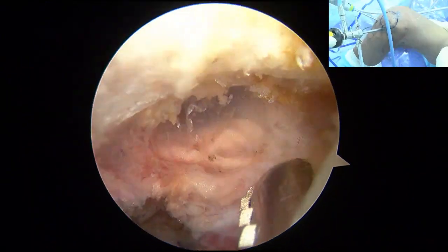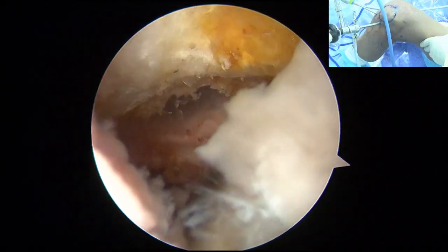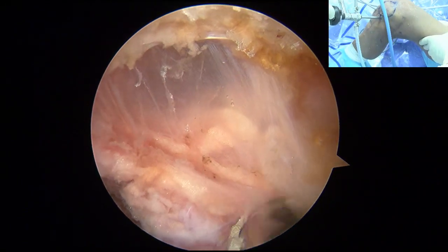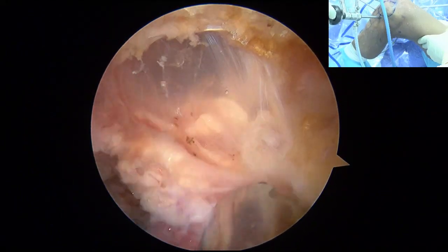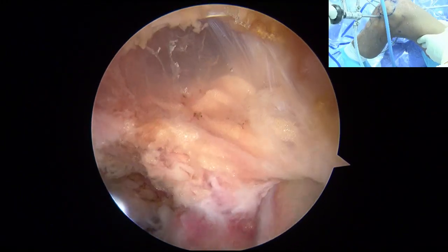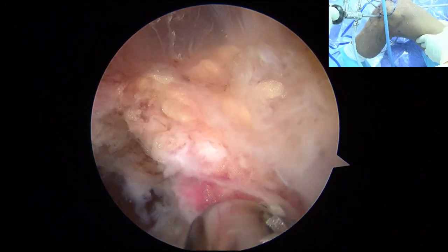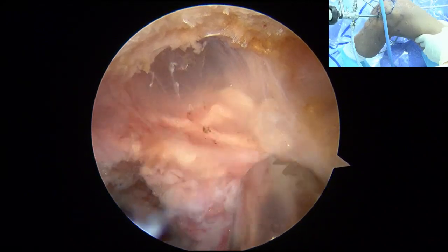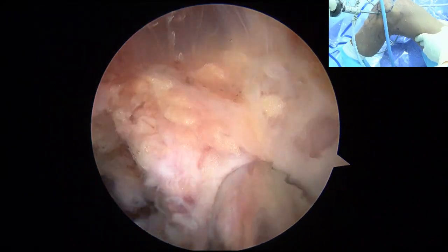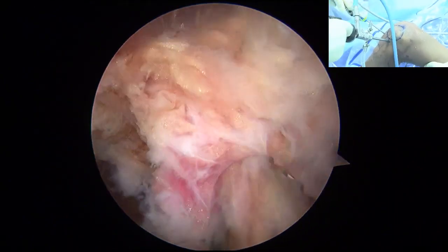Okay, now you're looking for the lateral side. 好，接下来找后外间室。Same way, okay. 用类似的方法。So use this shaver. 通过了韧带间入路，跑到后外。Yeah, so this is the posterolateral, just behind the ACL. Okay. 就在 ACL 的后方。Yeah, just behind the ACL. Same way.